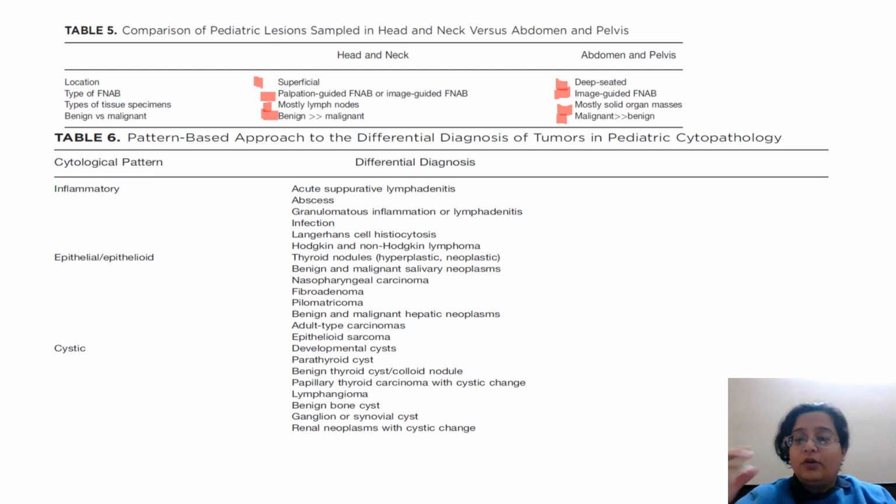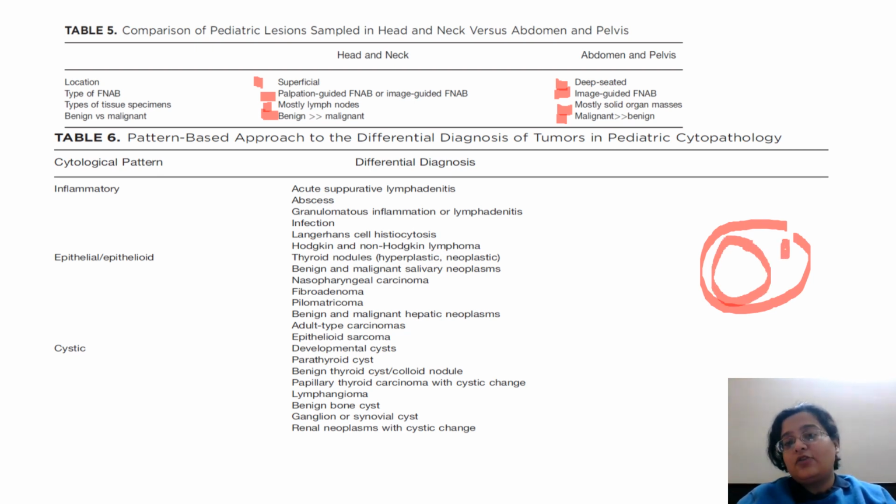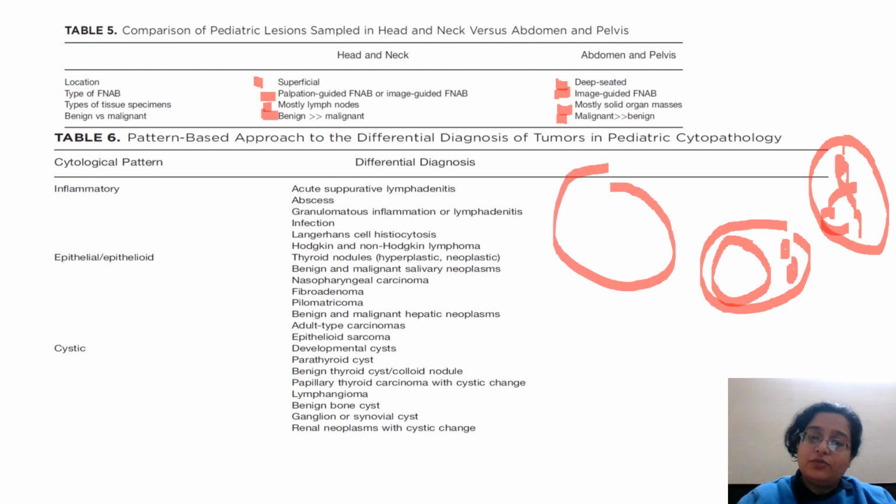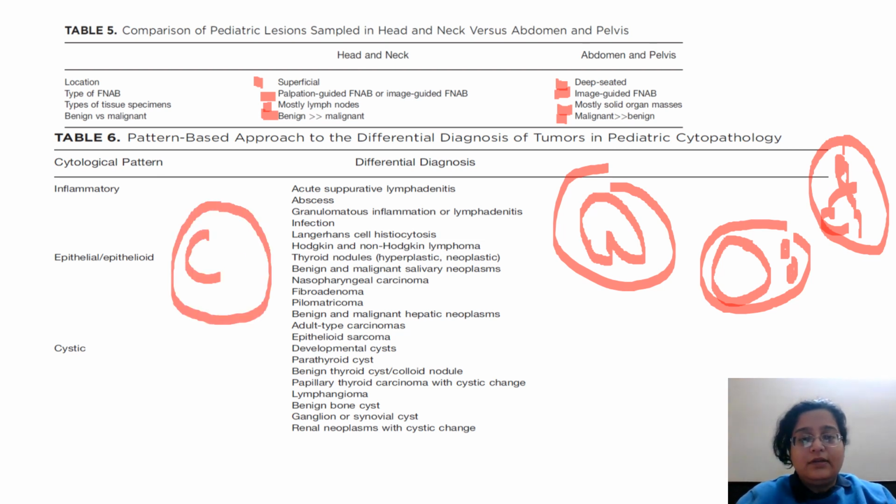Anaplastic large cell lymphoma will look like a reactive lymph node where there might be some inflammatory cells. You have to look for atypical cells with eccentric nucleus, something like this. This is my experience. That's what I'm sharing with you. With maybe cytoplasmic vacuolation, or you look for something called the florid cells, or you look for something with horseshoe-like hallmark cells in the FNAC that you do. If you are getting a granuloma on a background of polymorphs and eosinophils, not that much necrosis, you have to look for something known as the Reed-Sternberg cell. It must be there somewhere.